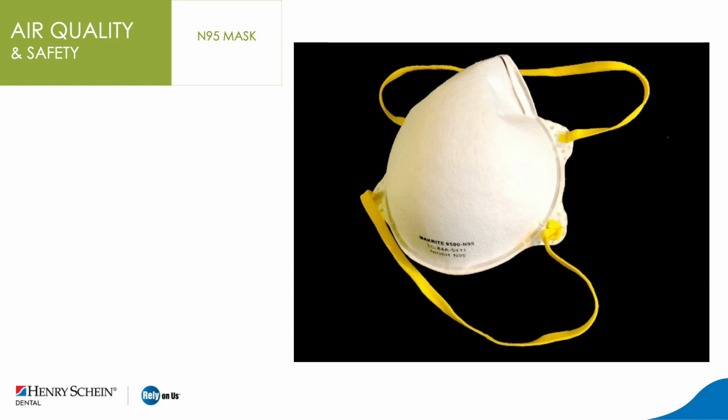Now, here's what I would call the caveat. You may need to take some oxygen breaks with this mask because some users become hypoxic. Okay? I mean, I know when I wear an N95 mask for any extended period of time, I'm just really happy to take it off and take some deep breaths of fresh air.